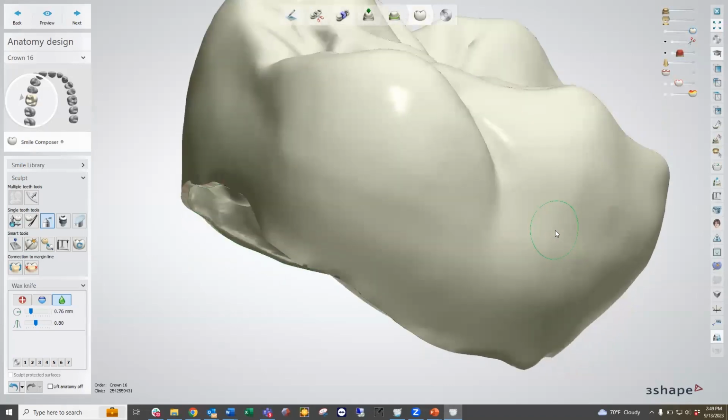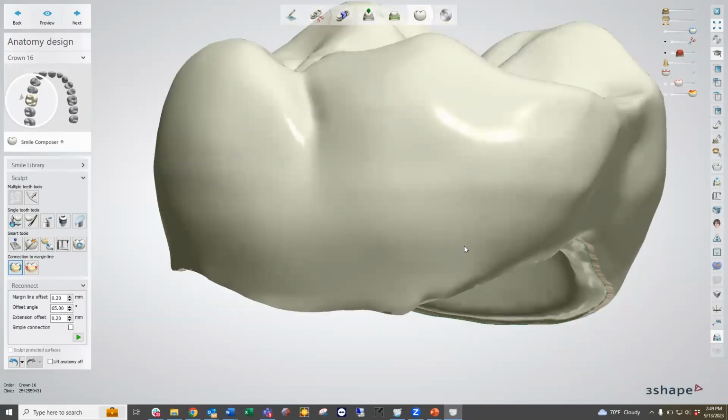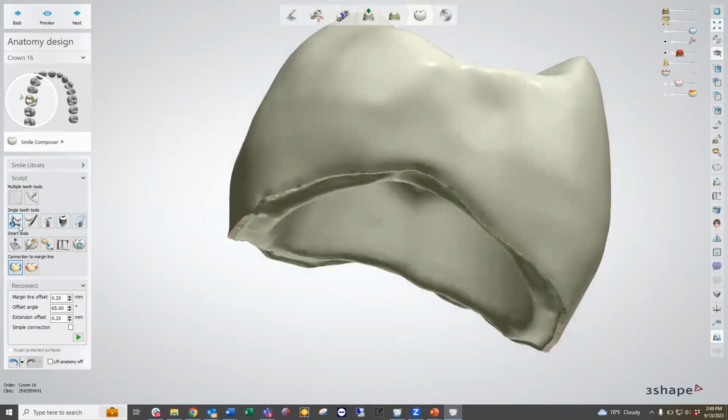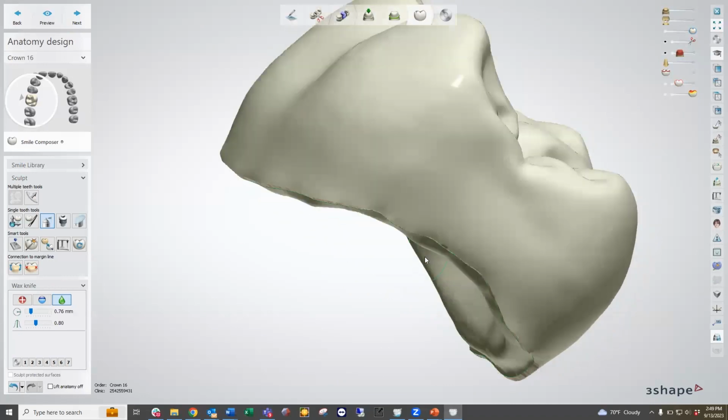Okay. And then what happened when I accidentally hit enter is it actually connected it already to the margin line. So I'm going to go ahead and just show you what that looked like. It just created this extension of the margin line out here, which is that chipping edge that we have. So we're going to go back and just smooth that edge with our crown. And this allows us to go ahead and smooth out our design.